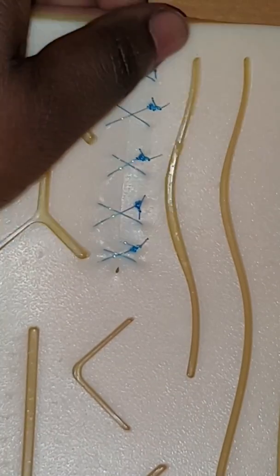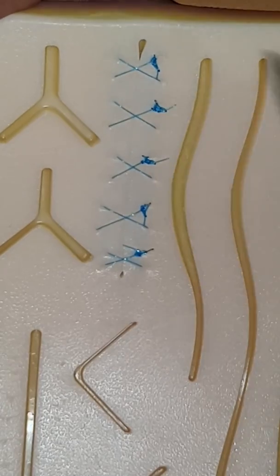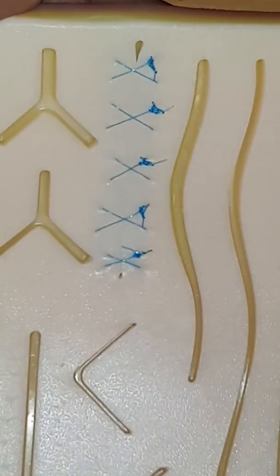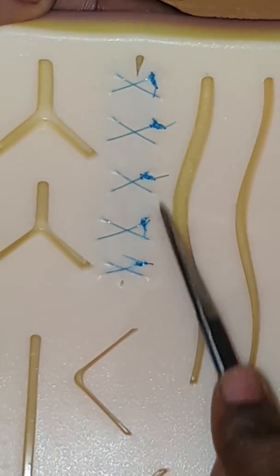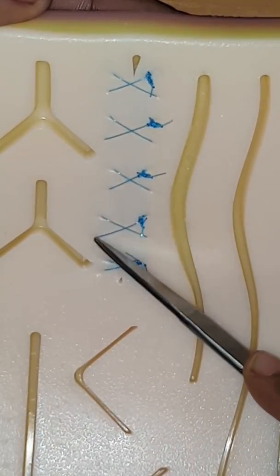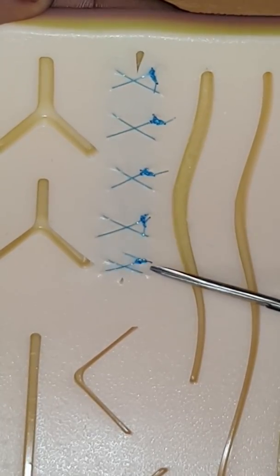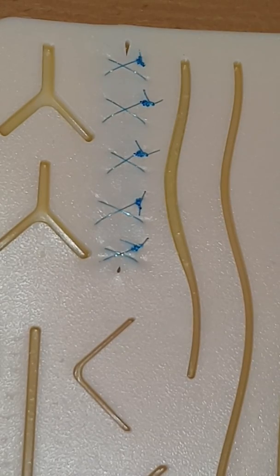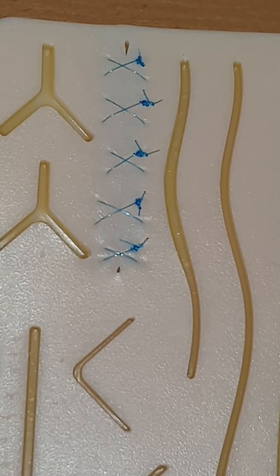That is done — this is your figure of eight suture, and you can probably tell by the name why it's called figure of eight. This suture pad is pretty old so it has a lot of prominent holes in here, so the sutures aren't as perfect as I would like, but that's okay. That is your figure of eight suture — I hope you enjoyed it. Stay tuned for my next suture video, which will be the interrupted horizontal mattress suture. Thank you for stopping by, see ya!